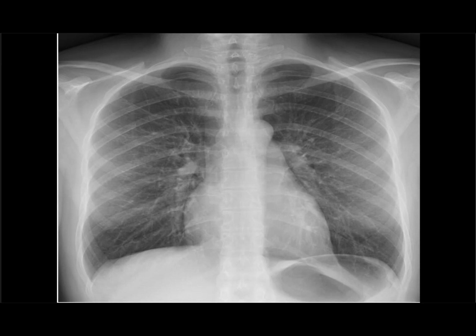This is a radiograph of the chest, commonly called a chest x-ray. In our previous video, I told you that the chest x-ray is normally taken in 3 views: AP view, PA view, and lateral view, okay? And that the PA view is the standard view. I equally taught you in that video how to differentiate the AP view from the PA view.